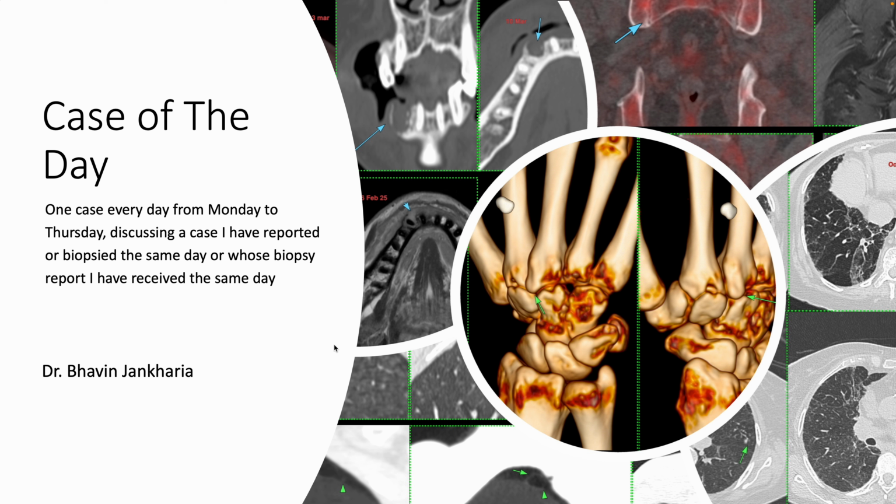And just for those who are new, this is typically a case that I've seen or reported or biopsied the same day, or whose biopsy report I've received the same day.